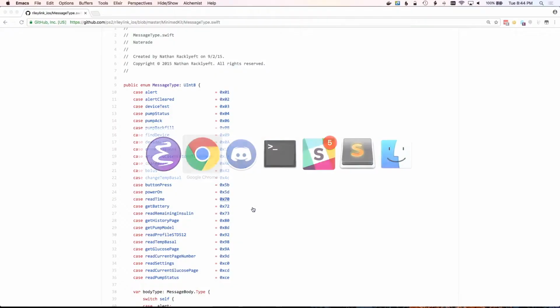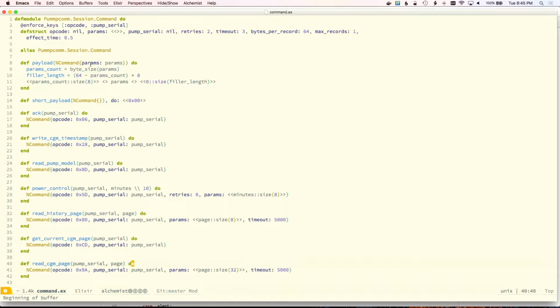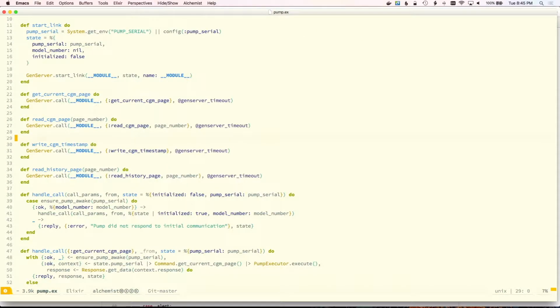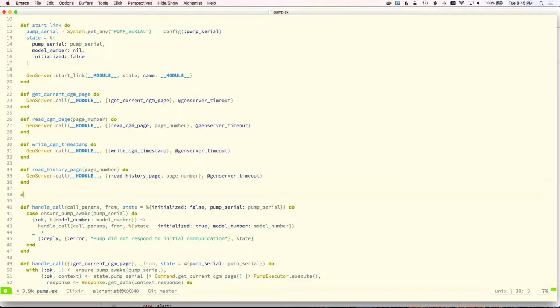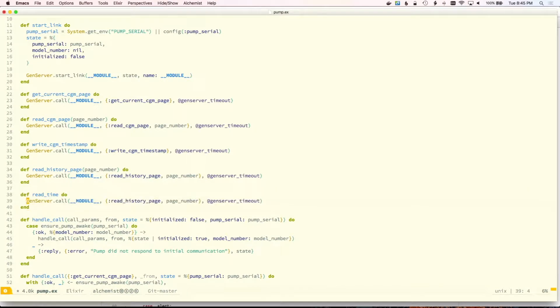So it looks like read time is, there's not a lot to it. I'm hoping this is pretty straightforward. I'm going to guess there are no params on this one. So I'm just going to add another GenServer call in here for read time.